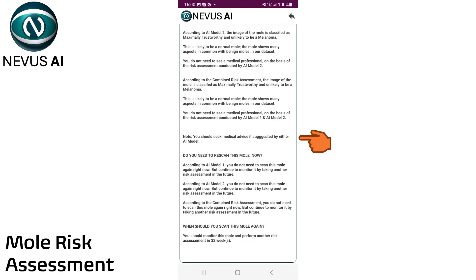If any of the AI models classify this image of your mole as high risk for melanoma, you will be advised to take another risk assessment immediately. You can either scan the same image of the mole, or if required, take a better quality image using our guidelines shown in the user guide.